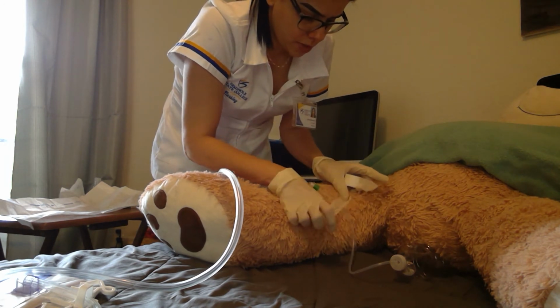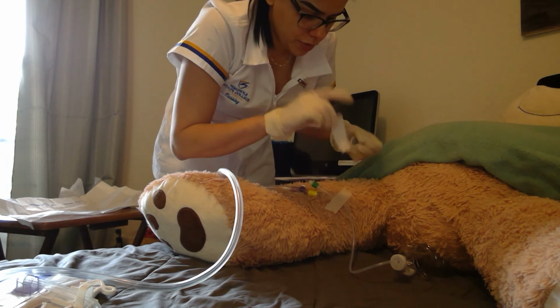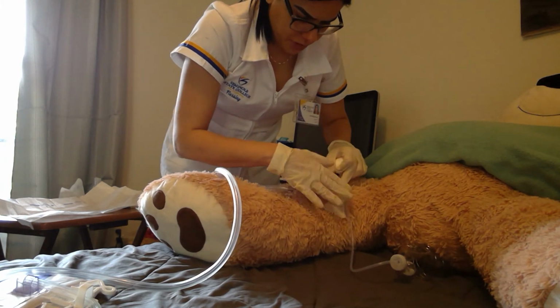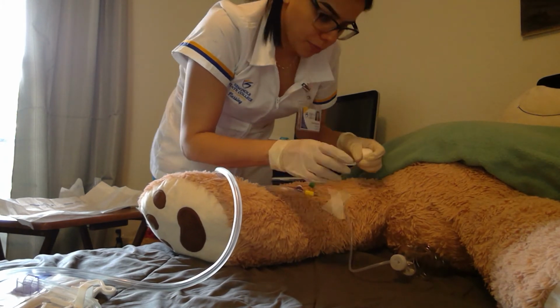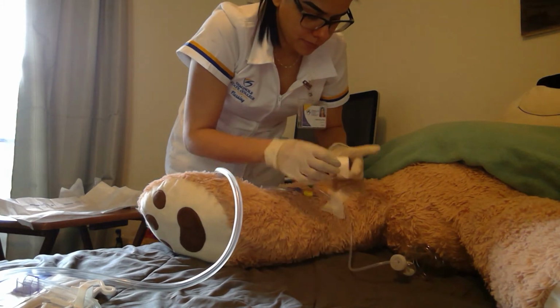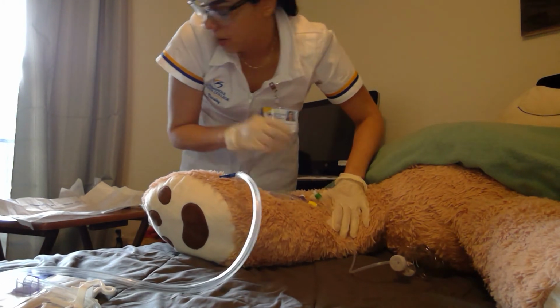And then right here, usually hospitals have a special attachment, and the tape is really hard, really sticky, where you can put all of this, tape it to the patient's thigh.